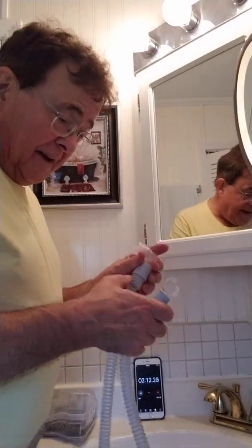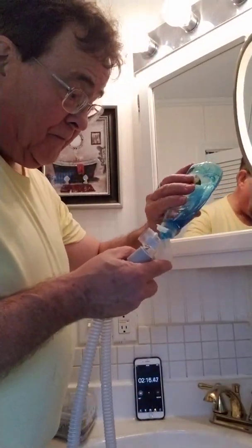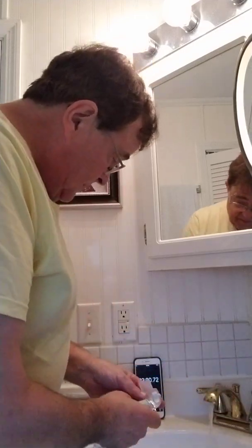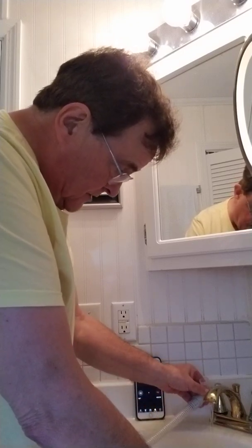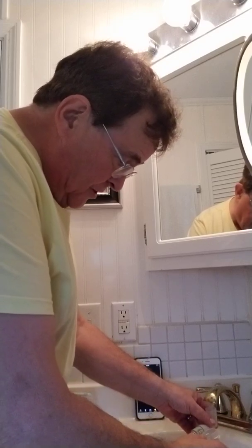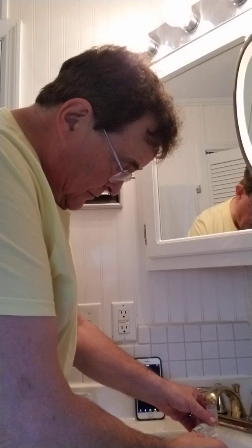Now they're next to the hose. How am I going to clean that hose? That's real easy. Just another dab of Dawn. Yes, sirree. So far, I'm into 2 minutes. And just a nice, slow, let's slow that down just a little more. Just filling that tube up. Yes, sirree.